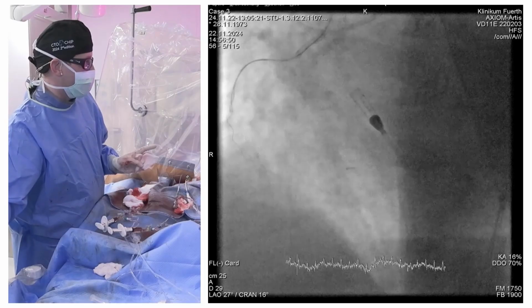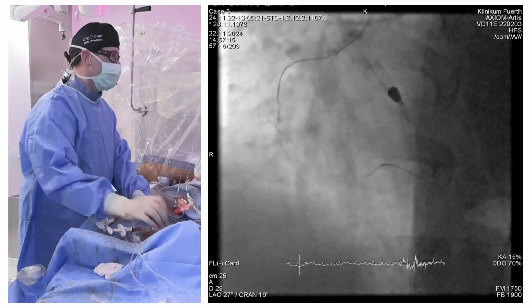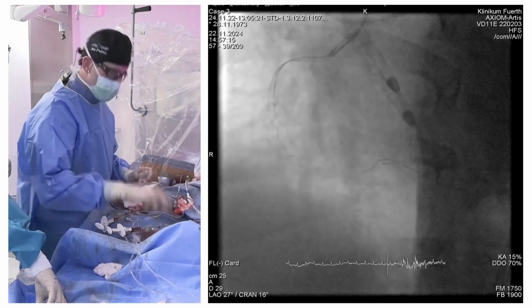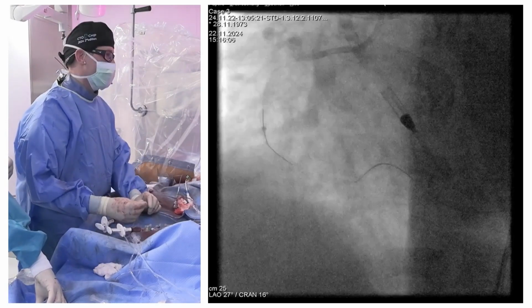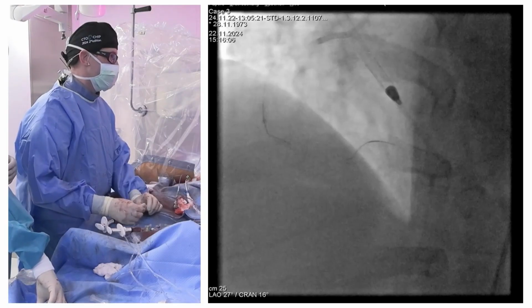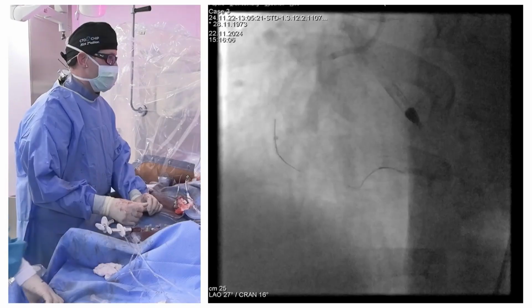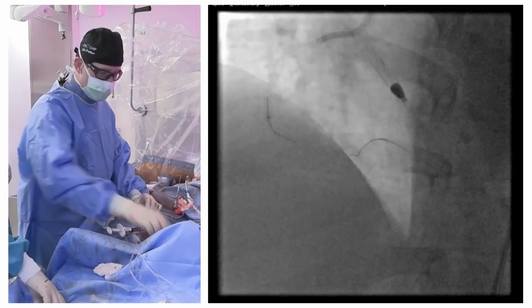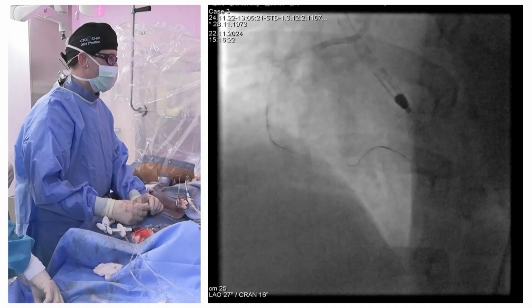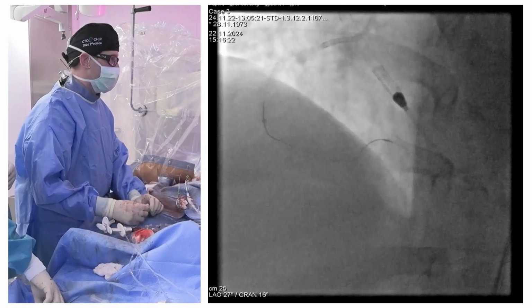The antegrade wire is still extra. So now we are trying to solve the problem with the retrograde. Again, we passed there one time, and then we advanced the guide extension antegradely until a certain point. But somewhere there we left the system, so right now we want to just re-enter, and I would like to do a rendezvous and swap to an antegrade approach, because I don't know how long that epicardial will basically last. Yeah, and that's where we are right now.